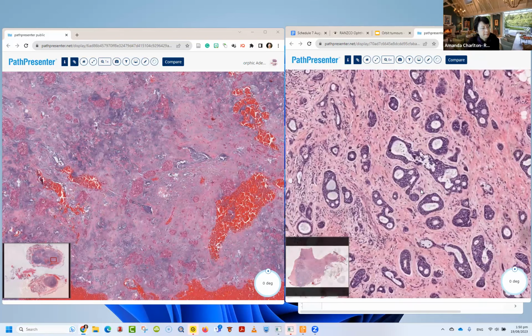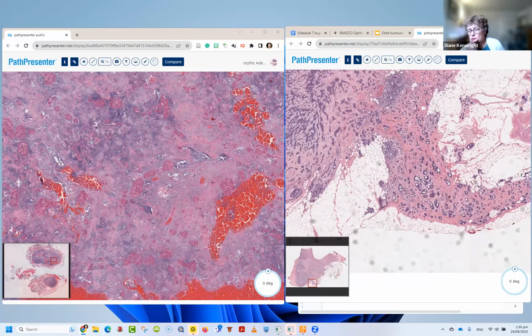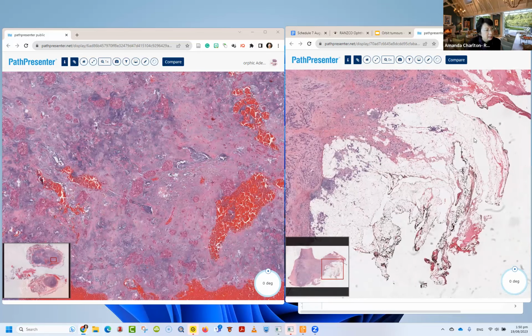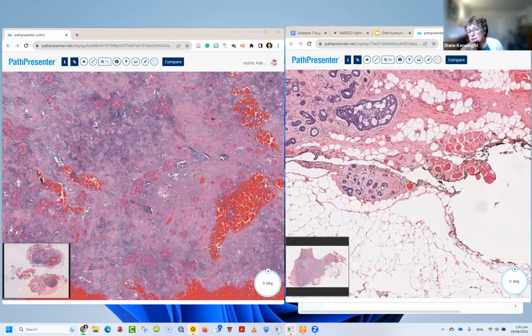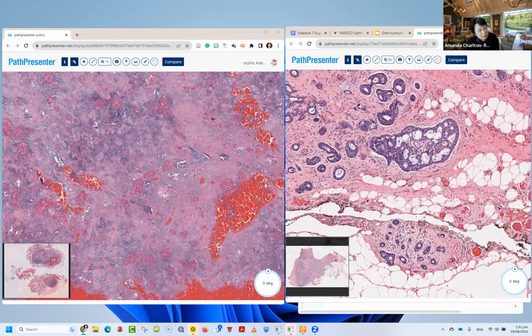Is it present at a margin? I don't see any ink, so I'm not certain that a margin is representative in this piece of tissue. There's a bit off to the right. Oh, is there? Over the other side. Oh, yes, there is here. So, okay, so I'm looking at the black ink here. Oh, I'm a bit suspicious. Yeah, up there it looks a bit dodgy, doesn't it? So there it is. Yeah, probably at a margin. Some muscle. Yeah, less than 1 millimeter. Could you just tell us again about, like, there's this blue myxoid stuff within the cribriform spaces.